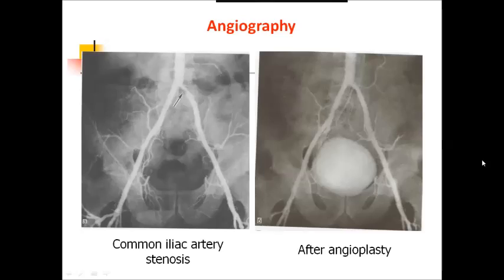Except for coronary arteries, angiography or contrast X-ray study may be used for study and evaluation of peripheral vessels.